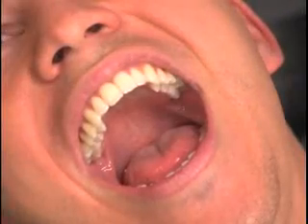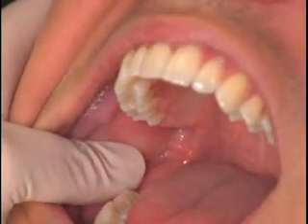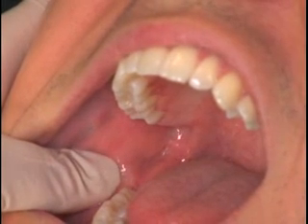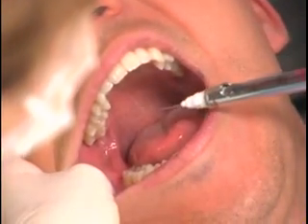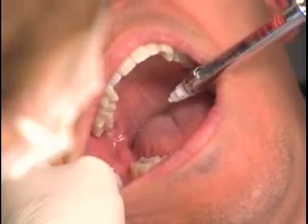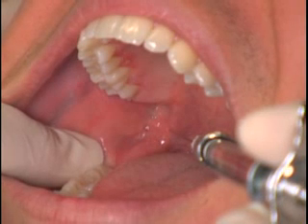A finger is placed on the lingual aspect of the ramus and pulled anteriorly until the coronoid notch is palpated. The coronoid notch is the greatest concavity on the anterior border of the ramus. The barrel of the syringe is placed in the corner of the mouth on the opposite side. The needle tip touches the most posterior aspect of the pterygomandibular raphe.